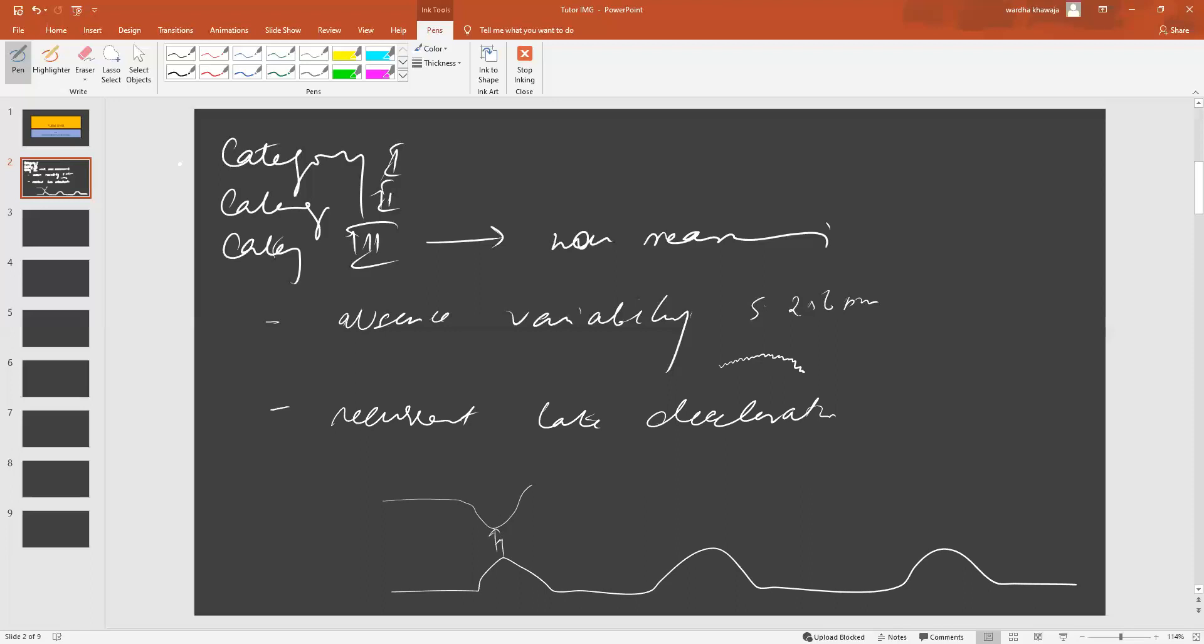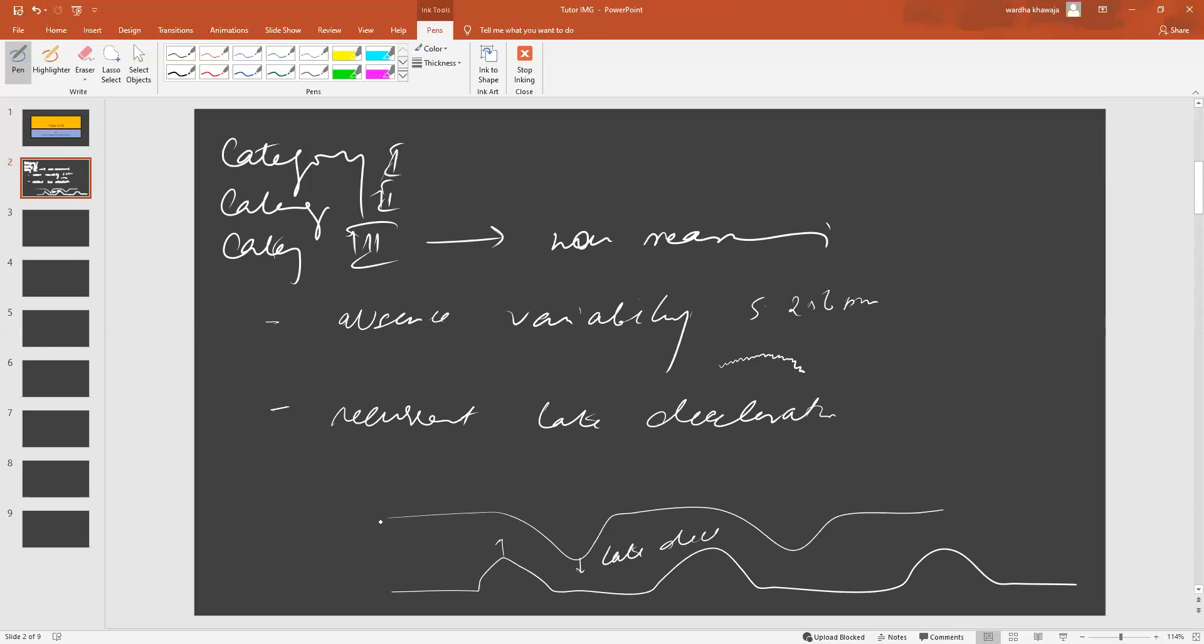However, there are times when this doesn't really happen. When this doesn't happen, what we end up seeing is something like this. When the peaks don't line up, we call this a late deceleration. Remember, the line is, of course, tremulous to indicate variability.